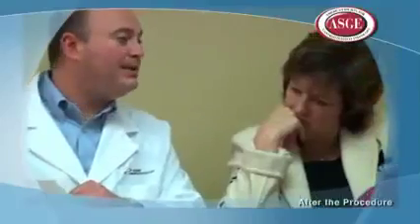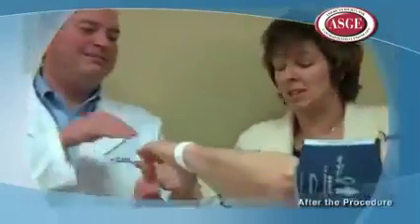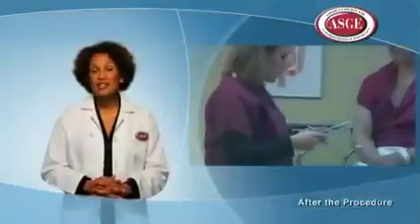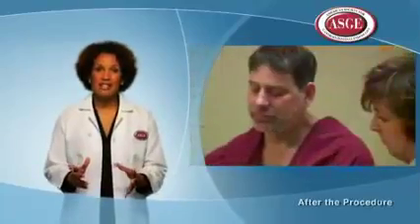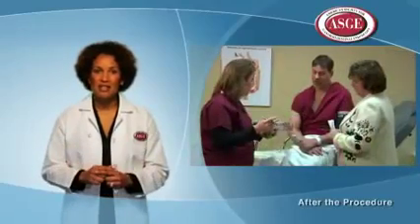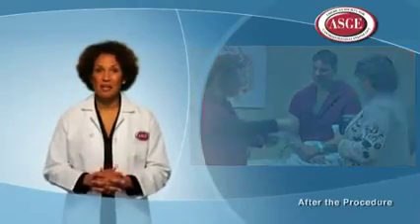It's quite common to have tissue removed during the test, which is called a biopsy. This does not necessarily mean that anything is wrong. Any tissue removed will be sent to a doctor called a pathologist for them to look at under a microscope. These results will not generally be ready right away, and they take several days to be completed. Before leaving the doctor's office, a member of the colonoscopy team will suggest how best to check on those results. You'll also receive instructions for what to do once you arrive back safely at home.